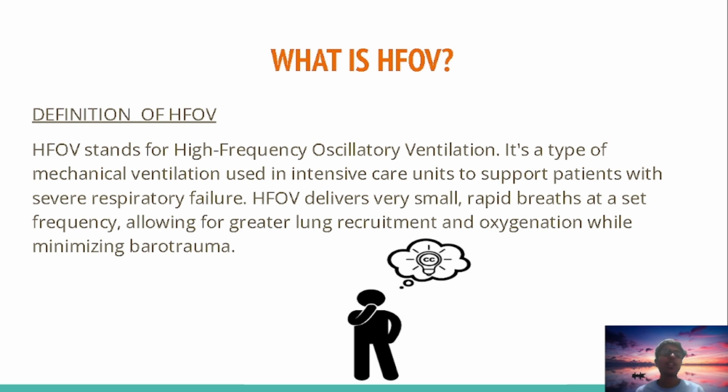So it is one type of mechanical ventilation. It is mostly used in intensive care units to support patients. Mostly it will be given for neonates; in adults it is rare. It supports patients with severe respiratory failure, and it delivers very small and rapid breaths at a set frequency. They will set a frequency. So it allows greater lung recruitment and oxygenation while minimizing barotrauma.